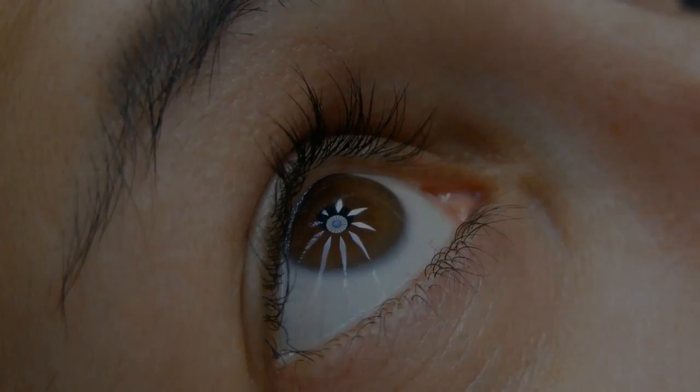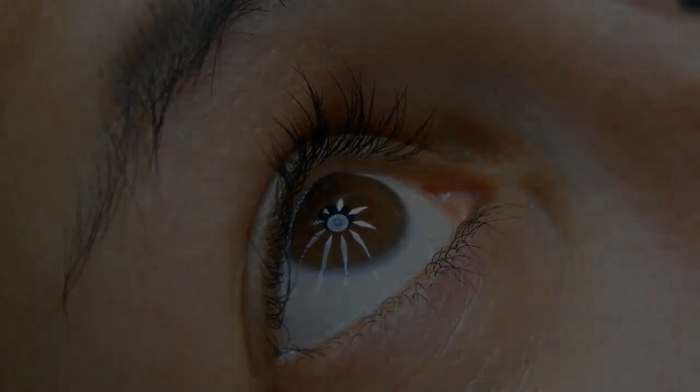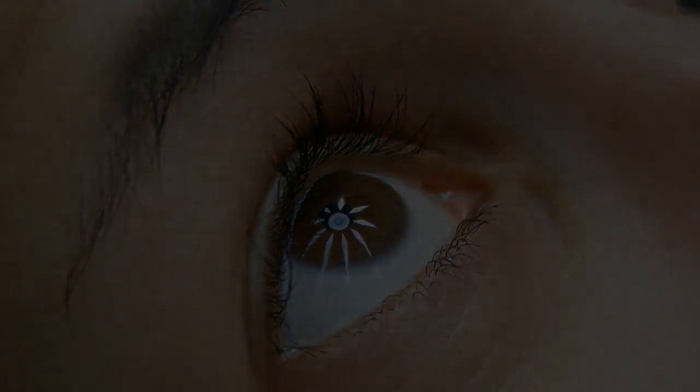The IMAX implant was developed by surgeon Bobby Qureshi and professor Pablo Artal, an optics expert at the University of Murcia in Spain.